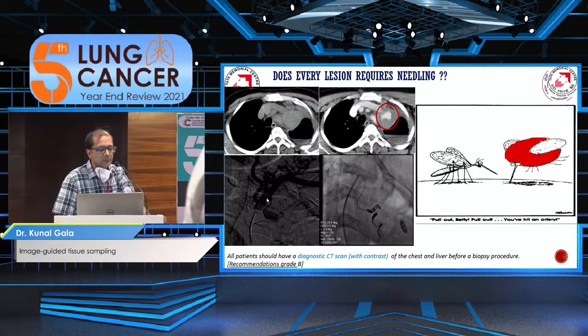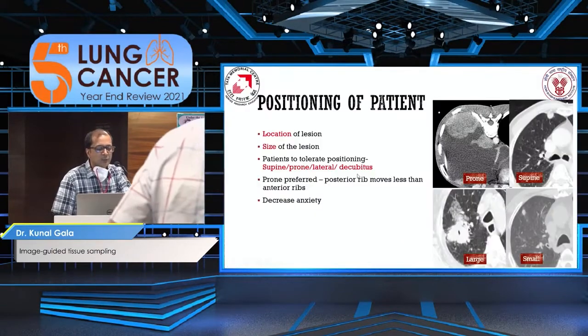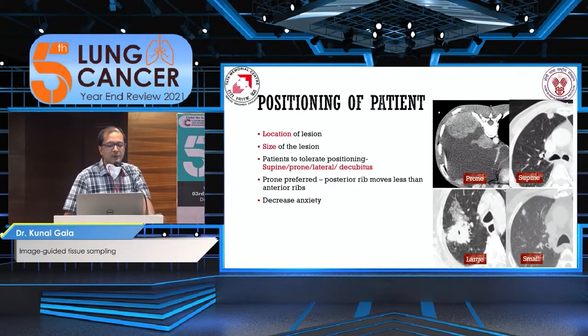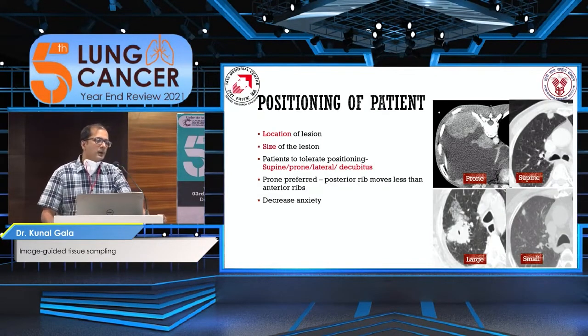This is an angiogram which is showing a pseudoaneurysm arising from internal mammary artery. And what you can see here is multiple coils which are placed and closing the front door and the back door of the aneurysm.